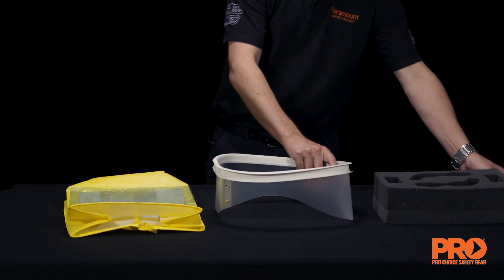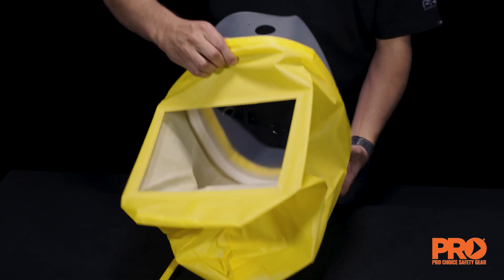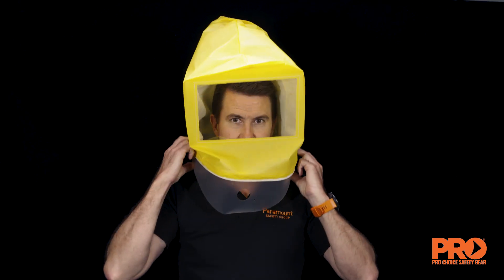Attach the hood to the collar by placing the drawstring between the flanges on the collar. Tighten the drawstring and tie off. Ensure the hole in the collar is facing to the front of the hood window panel.